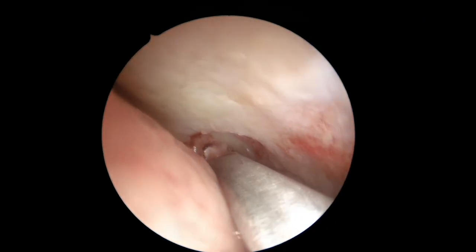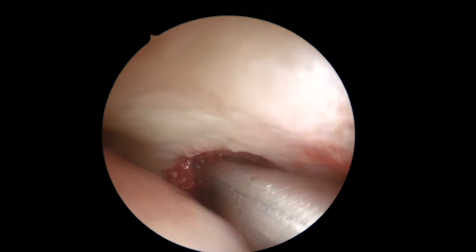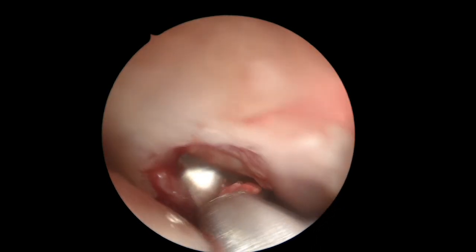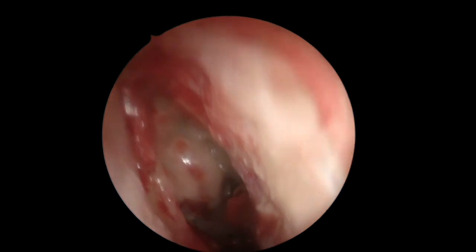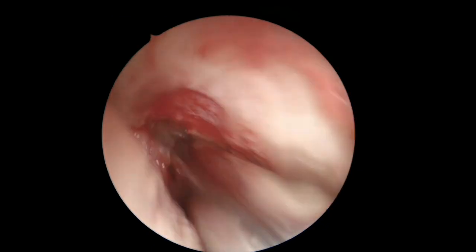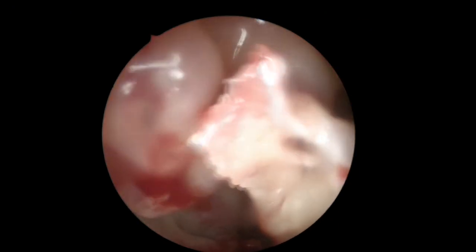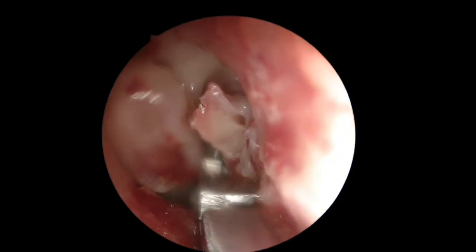If you expose it and you see the bone, you have a clear view of what you have to remove, as I'm doing here with the Kerrison forceps — to remove bone and get a view of the agger nasi cell and to address the fronto-ethmoidal cells, and hence the frontal recess. To engage the frontal recess, we have to remove most of the fronto-ethmoidal cells to see the frontal recess and the entrance of the frontal sinus.